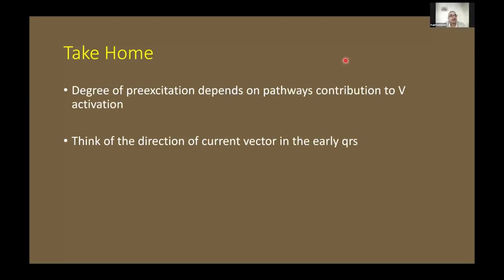Just one thing: underlying bundle branch block can sometimes complicate the ECG assessment, and that always has to be kept in mind. Very true. Very important point, Dr. Kapil. Thank you for bringing that up. Yes, that's absolutely correct. It might be a problem in older people as well.